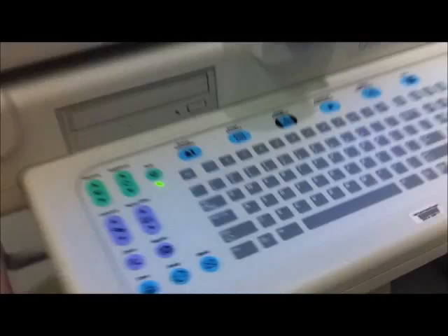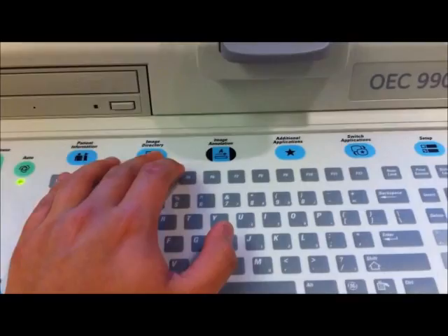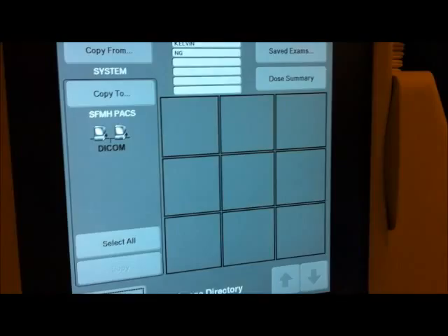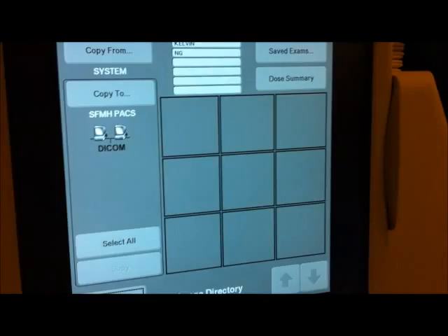That pretty much covers how the C-Arm works. Once you're done saving pictures, you can send them off to your PACS or print them out. Image Directory lets you go back and review your pictures. Looks like I didn't actually save any pictures today, but that's okay.